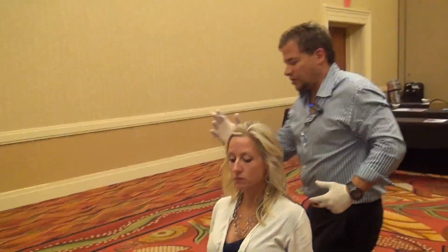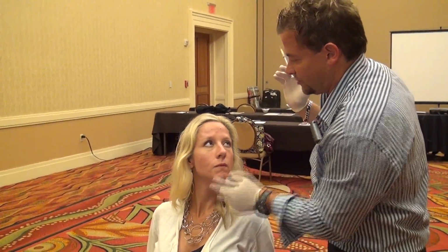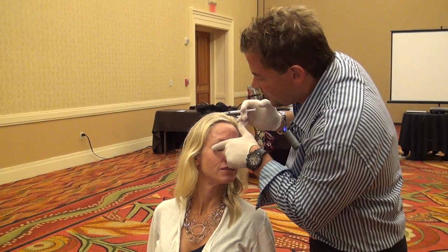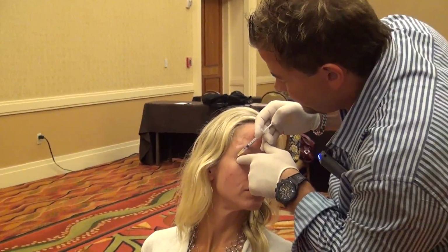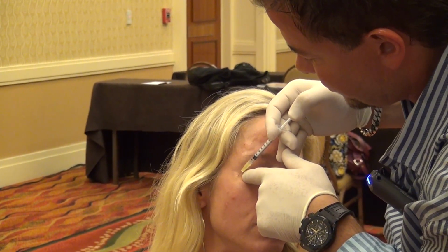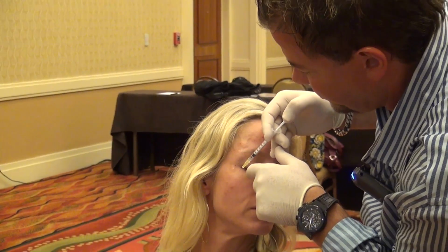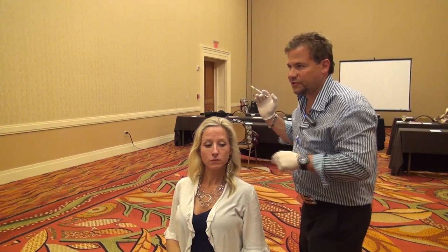Okay, now you come to the other side. See how I kind of walked around the person this way so they're not getting scared with the needle and all that? Not that she would, but okay, now kind of go like this. There we go. I just did 2. You could do a lot more, and you're going to go completely around that way. So I left some extra ones there.